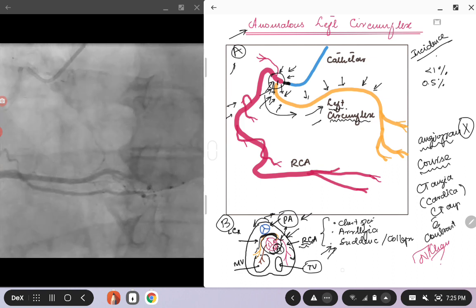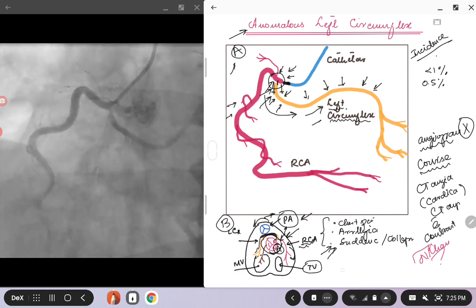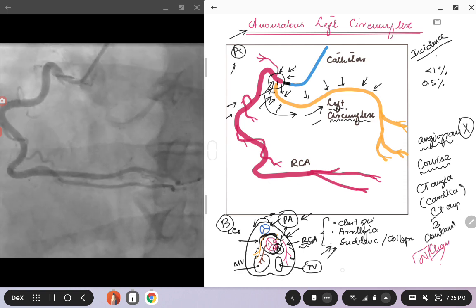So I hope this was helpful. This was a very short talk on one of the common anomalies that we come across.